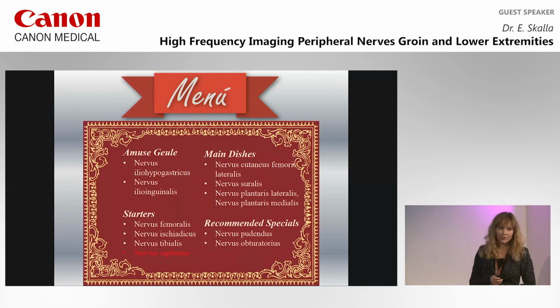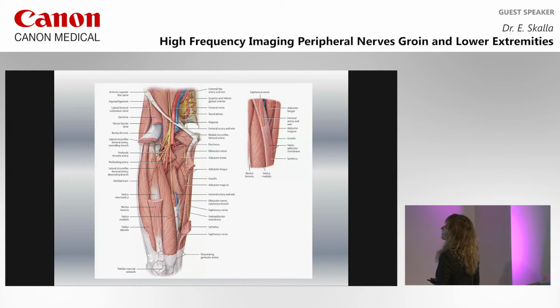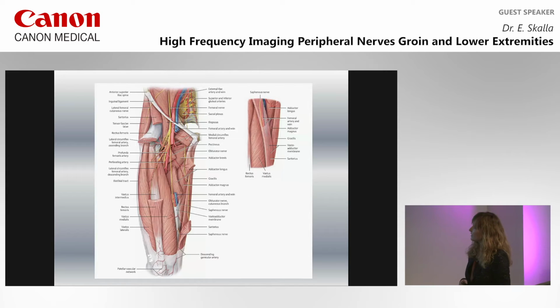Another sensory nerve, the saphenous nerve. It's bigger than you would expect, and just once again to the anatomy.